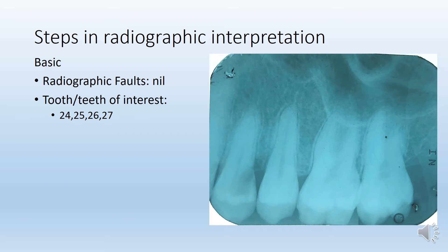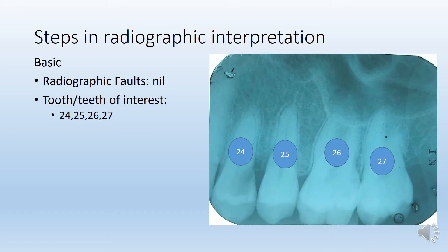Moving on to identifying the faults — in this particular radiograph, I don't really see many faults except for a few scratch marks. Otherwise it looks good enough, and the teeth look in well proportion. The teeth of interest are 2.4, 2.5, 2.6, and 2.7 — that is the first premolar, second premolar, first molar, and second molar.